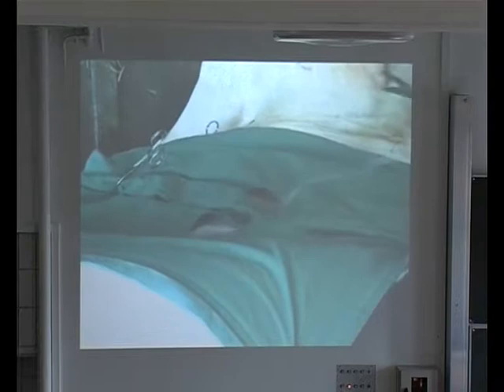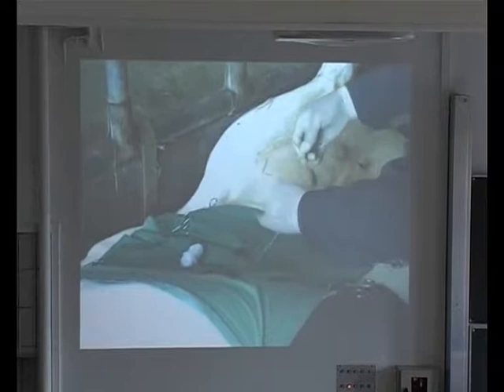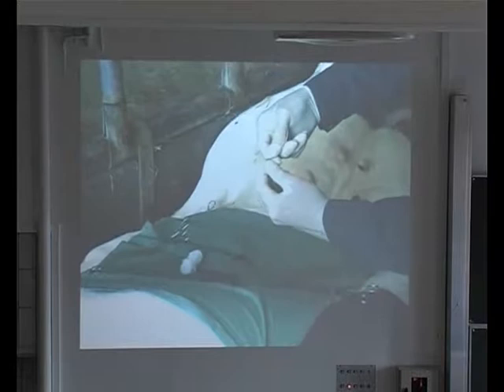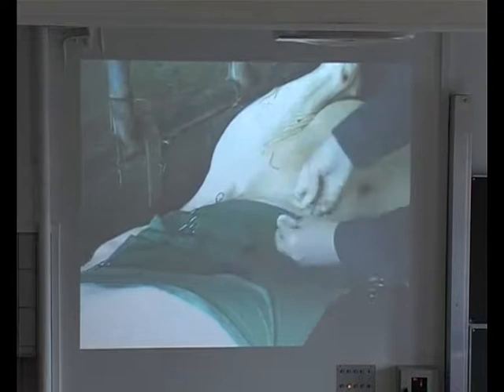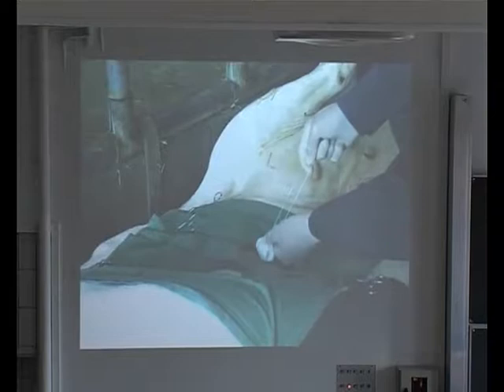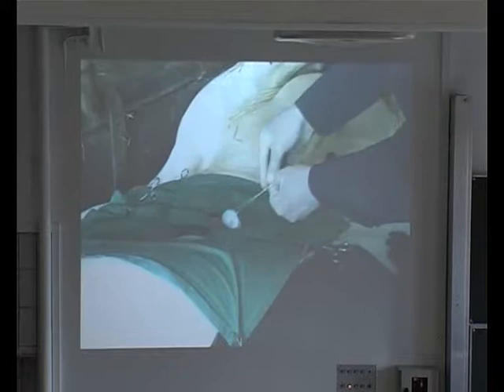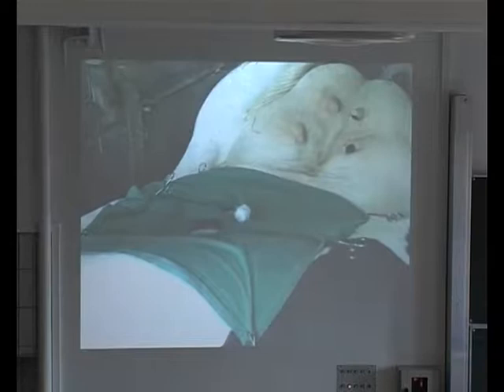And now we fix our thread ends, piercing a wound gauze, our double thread end, and we fix it without tension. We see the black mark on the thread ends to identify the position of the abomasum to the abdominal wall. And this wound gauze, we remove 3 weeks after the surgery. I think we need 3 weeks. And then we have a very strong adhesion from the abomasum to the abdominal wall. Now here you can see the umbilicus and the position of the fixation.